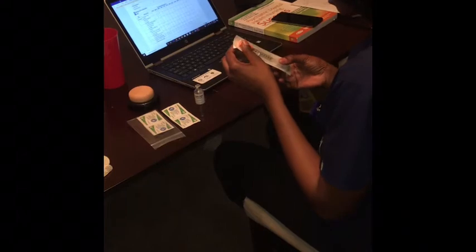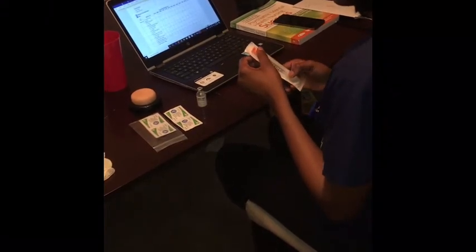The next thing I'm going to do is select the syringe and the needle. The syringe I have here is the 100 unit syringe, because the patient is receiving 58 units of insulin. I also prepared my supplies here. I have my needle container, the red container, for disposal, and I also have the alcohol swabs and the gloves, and that's where I'm going to be doing my demonstration.